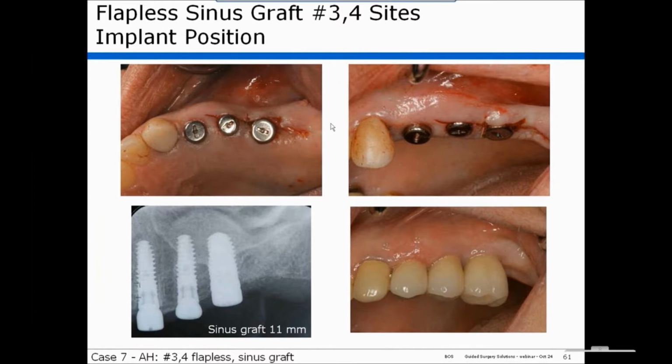It's even conceivable that someone could use, let's say on three implants placed, perhaps it's 2 bicuspids and a molar, it's possible that they would use the tube guide for the bicuspids. But because of the position of the molar and vertical clearance, they may not be able to use it on the molar. They could just slip in the thin layer guide and they're still in business. But do you provide tube guides, or do you recommend thin layer guides in all situations? No, we provide tube guides. We call them thin layer tube guides. You've seen some. I'll show you one in a minute. And we provide thin layer guides without tubes. We provide both in every case.